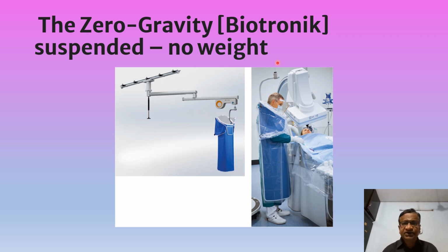The Zero Gravity Biotronic, you can see here, this is slightly sliding and this is dropping down like this, and a person goes inside this. He is not wearing any weight also. No bearing of weight. It is simply coming down from this sliding grip. You can see this rod.